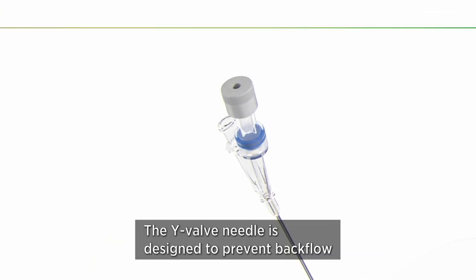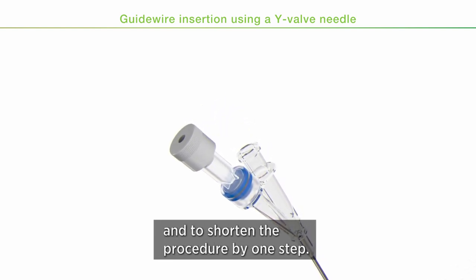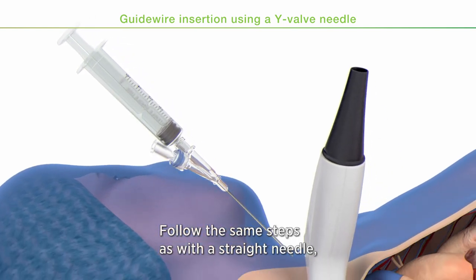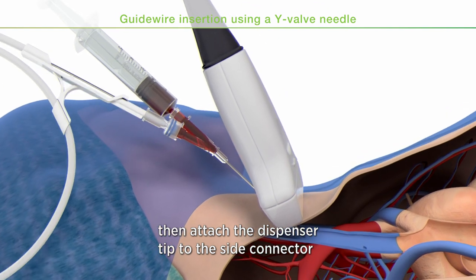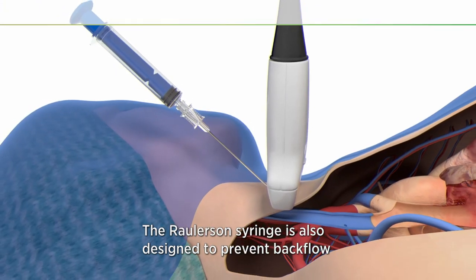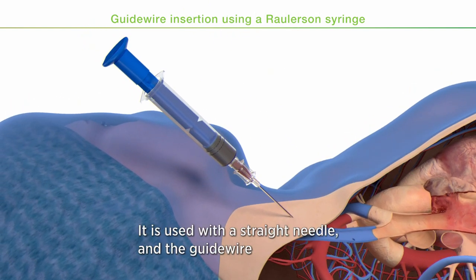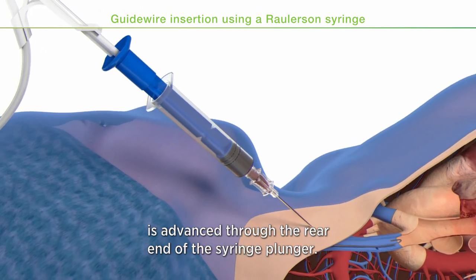The Y-valve needle is designed to prevent backflow of blood during guide wire insertion and to shorten the procedure by one step. Attach the syringe to the straight-through connector on the Y-valve needle, follow the same steps as with the straight needle, then attach the dispenser tip to the side connector and advance the guide wire into the vein. The Raulerson syringe is also designed to prevent backflow of blood; it is used with a straight needle and the guide wire is advanced through the rear end of the syringe plunger.